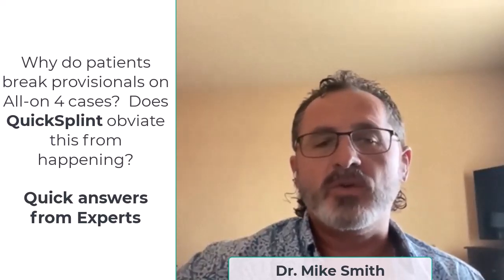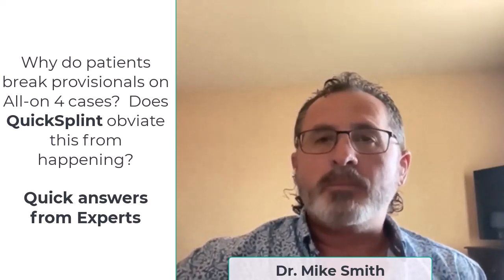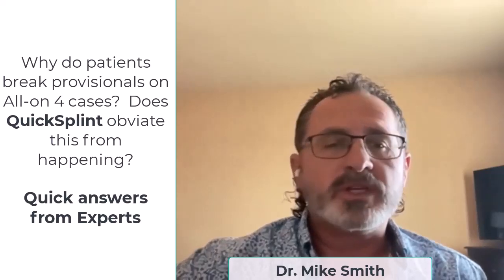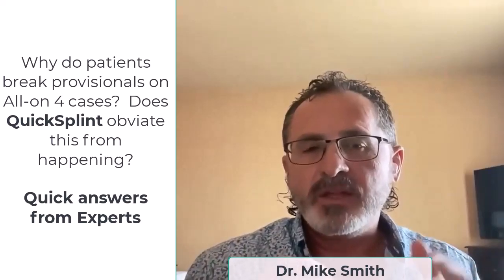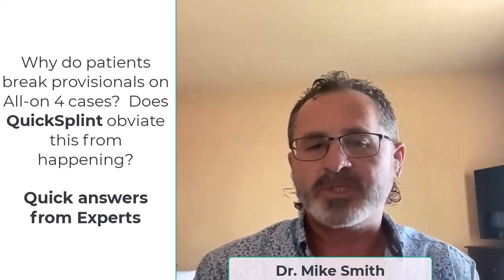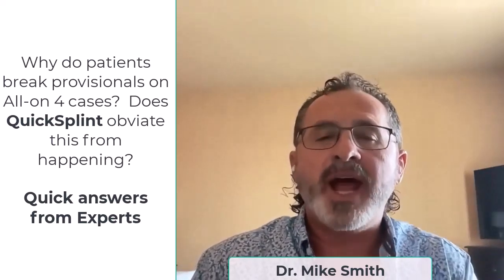So the question is, for all-on-4 cases, why do some patients break the temporaries? Well, you have to think about proprioceptive response. When you take all the teeth out and you put implants in and you put this bar, this overdenture, this restoration in place, they lose the feeling of where their jaw's supposed to be, how they're supposed to connect, how they're supposed to occlude, how they're supposed to hit. Well, when they smash, crash, and bash, they can break things very easily because their jaw doesn't know where it's going. It hasn't trained itself.